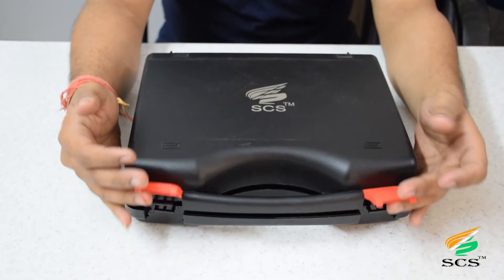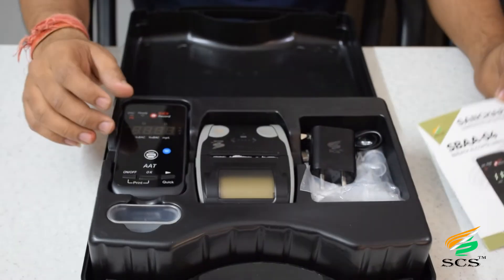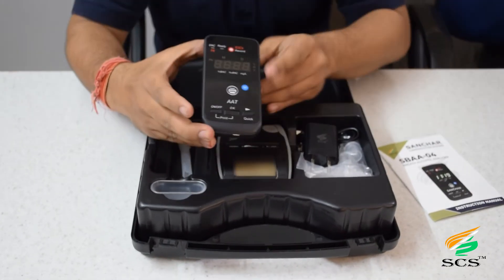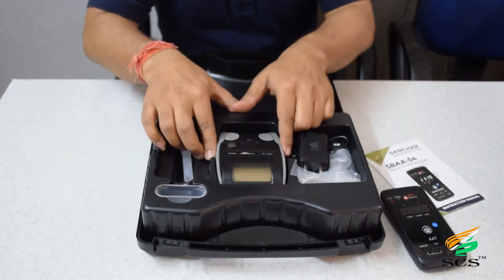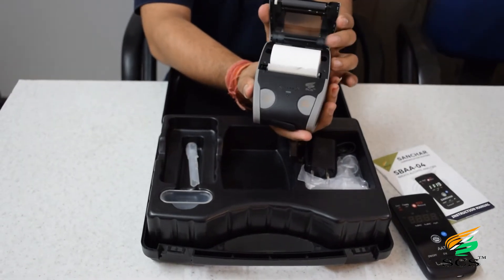As soon as you open the box, you will see the instruction manual. This is the Sanchar Breath Alcohol Analyzer 04, this is the thermal portable printer, and this is the thermal roll.